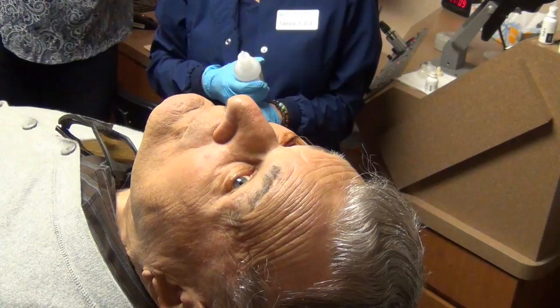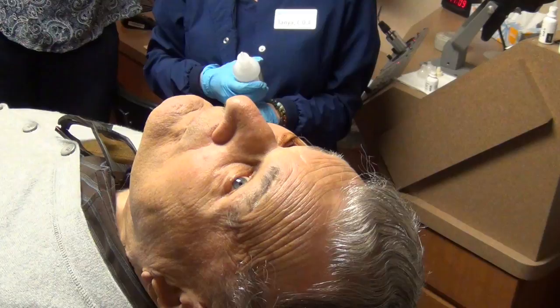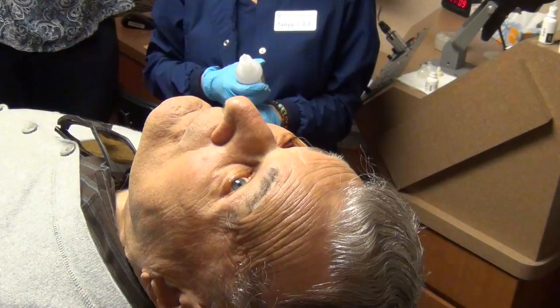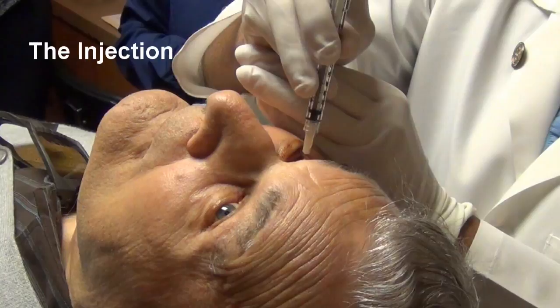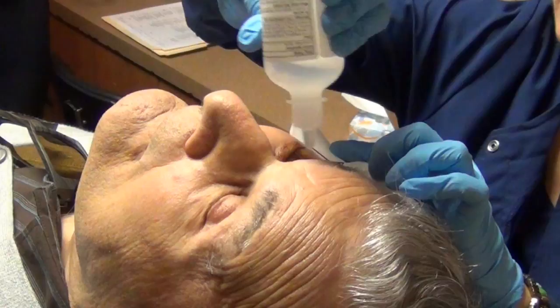At this point Robert is very, very numbed, so he doesn't feel anything. Robert, I'm going to keep looking up and to your left — just like you are, that's absolutely perfect. And we are done. I'm going to rinse your eye — Robert did absolutely perfect.